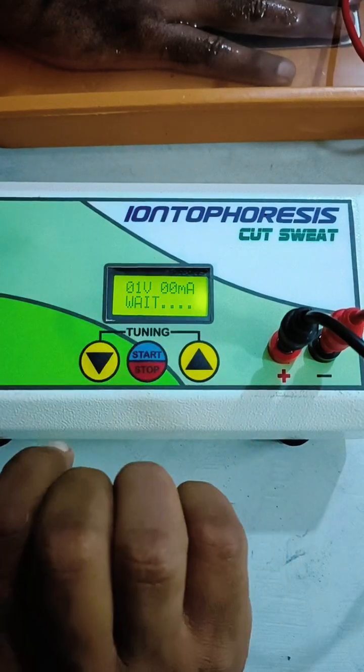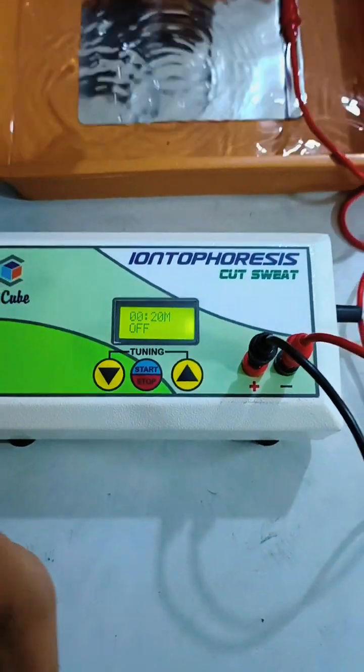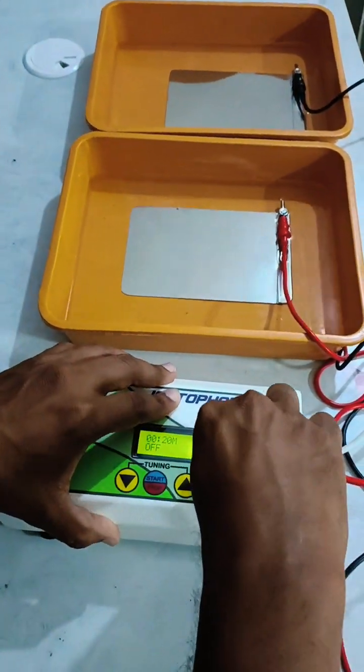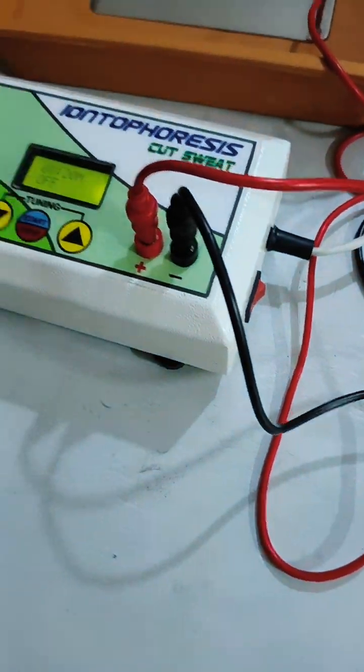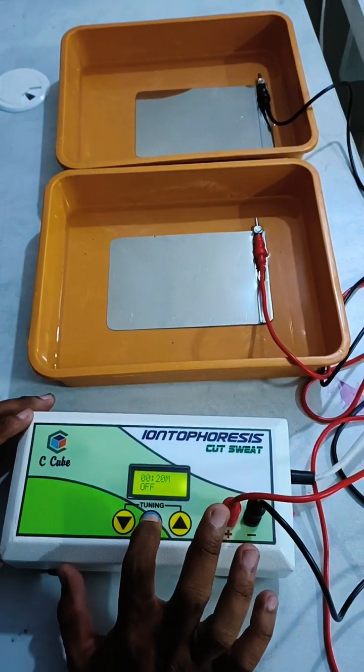The device is now off. Remove your hand, then change the polarity of the electrodes — positive to negative and negative to positive — to deliver the treatment in reverse polarity mode. Then start the treatment again.